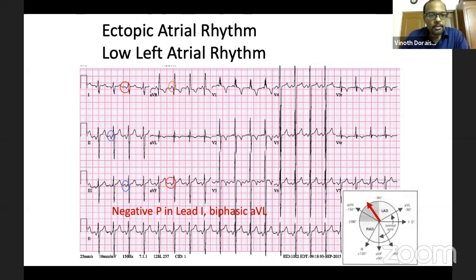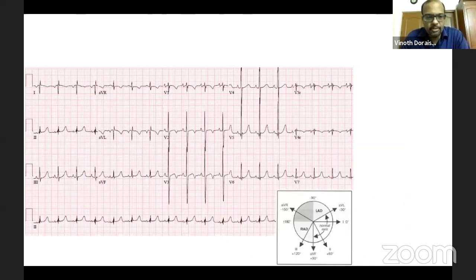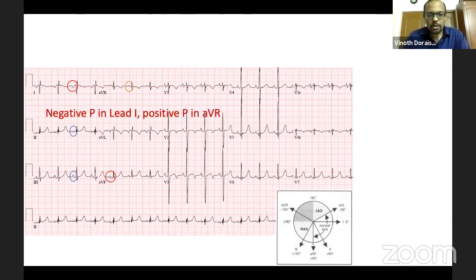Next, coming to the next patient. So again, we'll want to calculate the P wave axis. So the P wave axis we'll see in first lead 1 and lead AVF. So it is negative in lead 1 and positive in AVF. It is also positive in the inferior leads. And it is also positive in AVR. Okay. So now the direction of the P wave axis, if it is positive in the inferior leads or positive in AVF and negative in 1, it has to be in the direction of the red arrow, which you can see on the screen, and it is also positive in AVR.